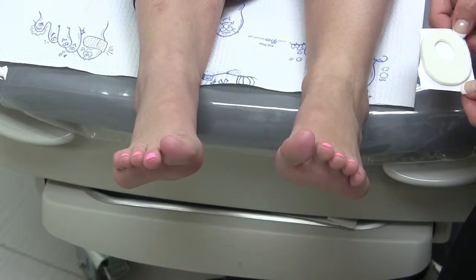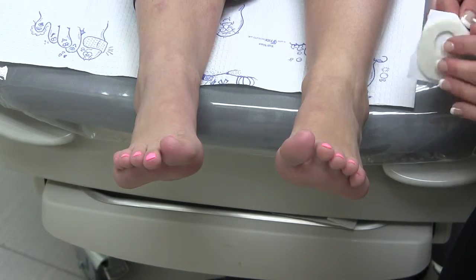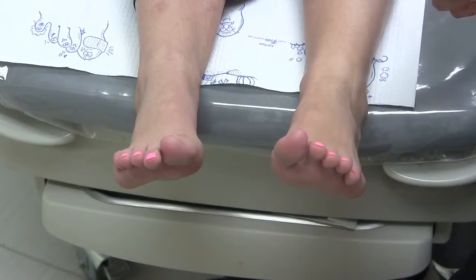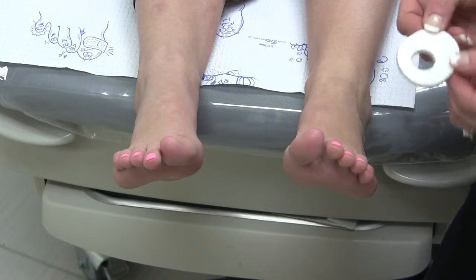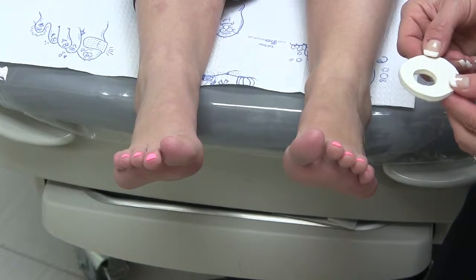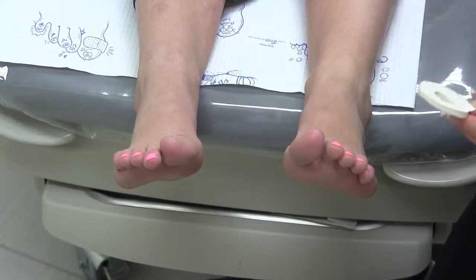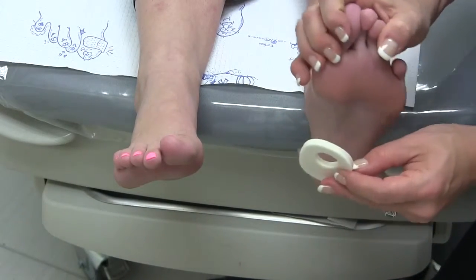Many patients prefer the felt callus pad because it's very sticky. Once you put it on, it's actually going to stay stuck on your foot for several days. With this type of adhesive pad, you want to let it fall off naturally. Generally it will stay on for about up to three days, and you can shower with the pad.